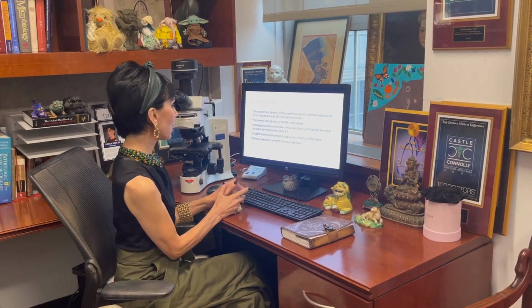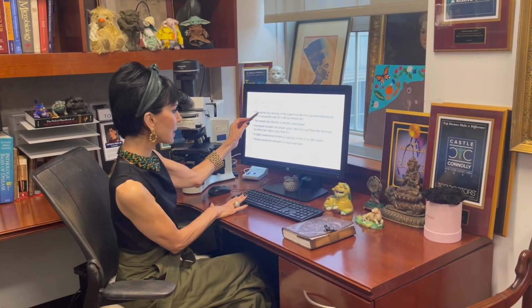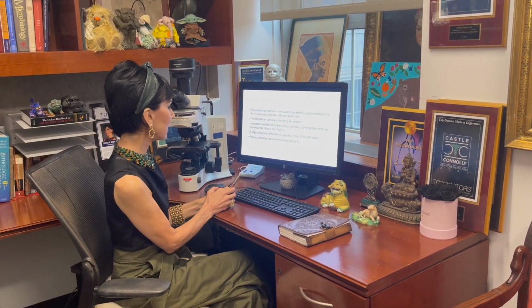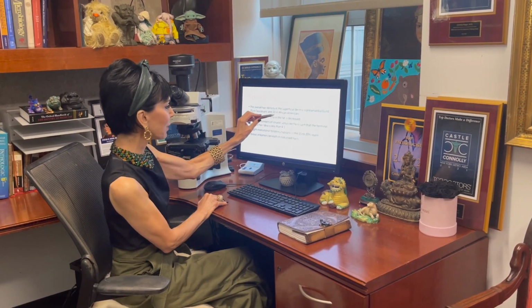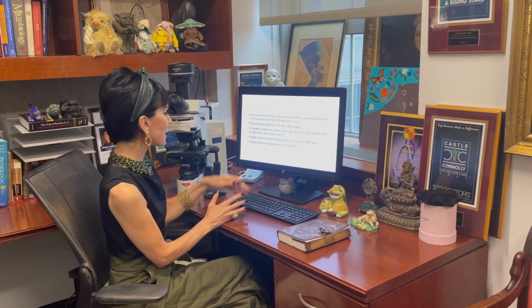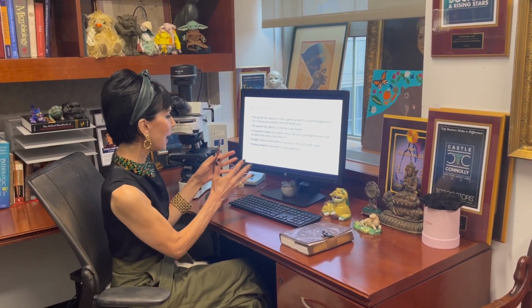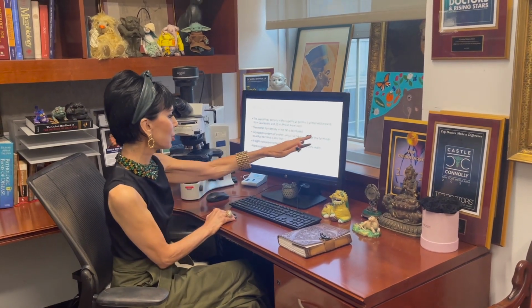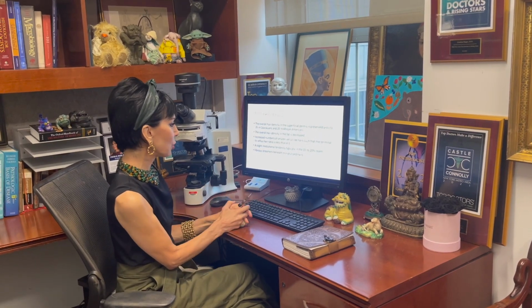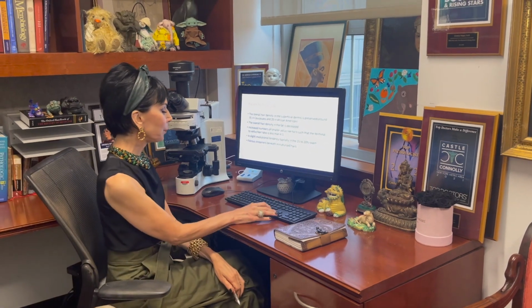So what is the baseline histology? The overall hair density in the superficial dermis is preserved, around 35 in Caucasian, 20 in African American. But the hair density in the fat, which is where you find those big terminal hairs, is decreased. As I was mentioning, the terminal to vellus hair ratio is typically less than 4:1, and there is a slight involutional tendency, not to the magnitude that one sees in alopecia areata, for example, where there is also hair miniaturization and involution, but the involutional tendency is so much greater.